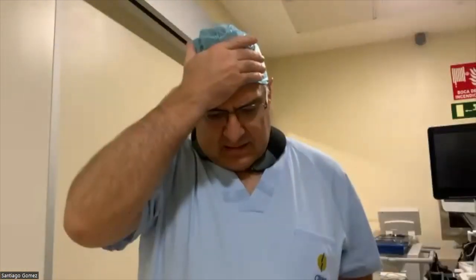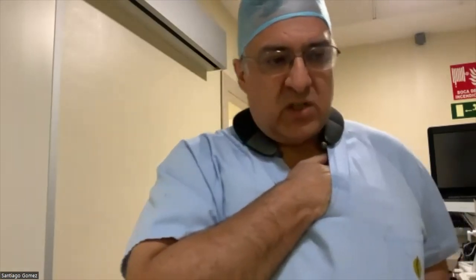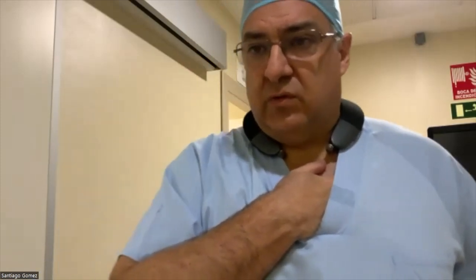Oh, yes, I would say that very small prostates are difficult, because the plane is not very well developed. I wouldn't recommend to start with 40 gram prostates and smaller. My recommendation would be to start with probably 50, 60, because if you have any trouble, you can manage the situation with a TURP. You can convert, you can get out of trouble. If you have to do initially a 120 gram prostate, of course at the beginning you are a little bit slow with your dissection, you have to check many times, and it will become very long, you will get tired. Of course there is some stress at the beginning, and if you're stressed you will be wasted.